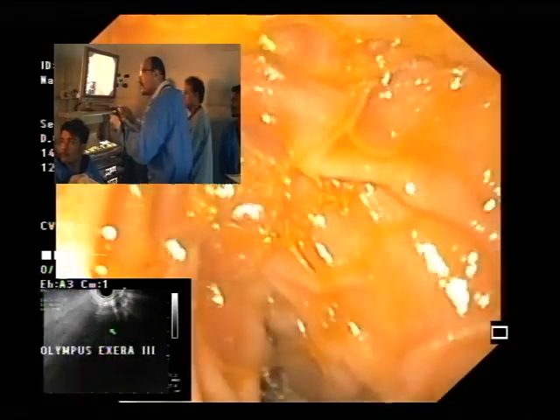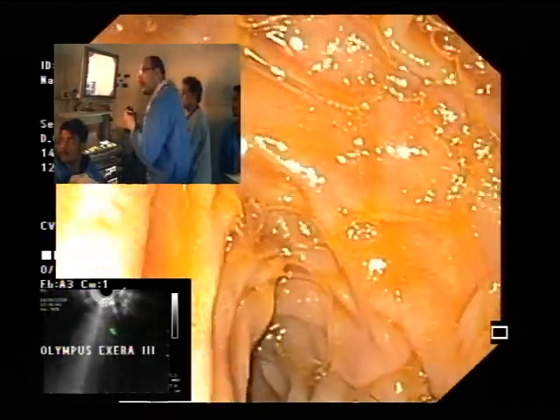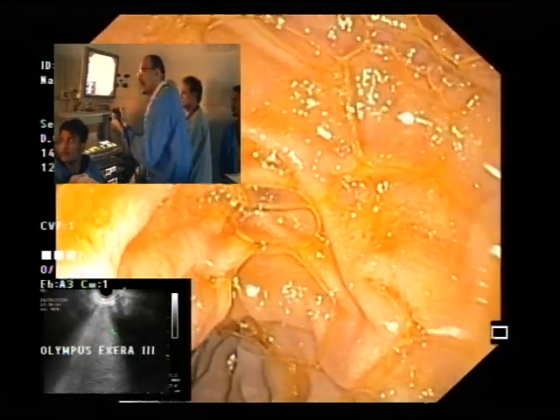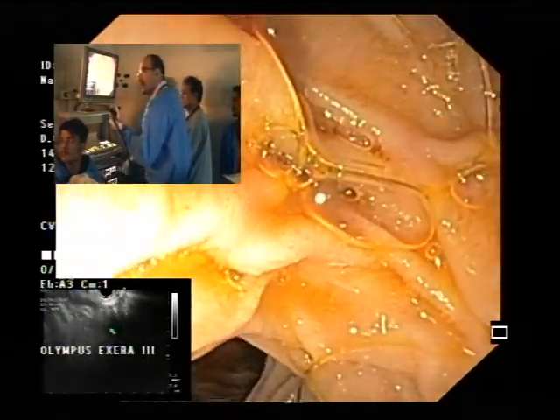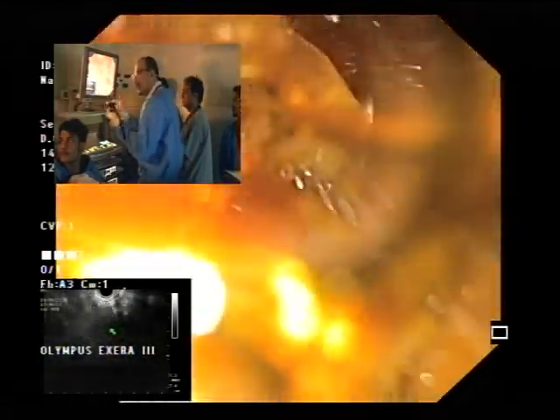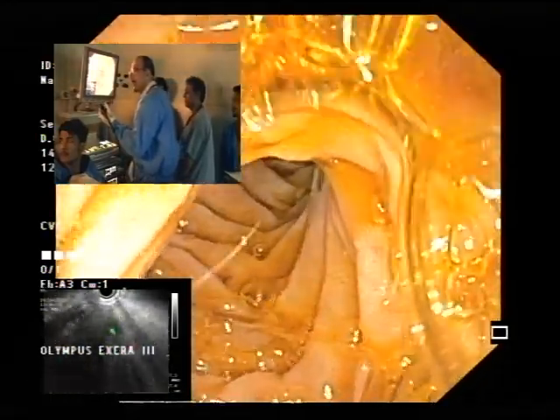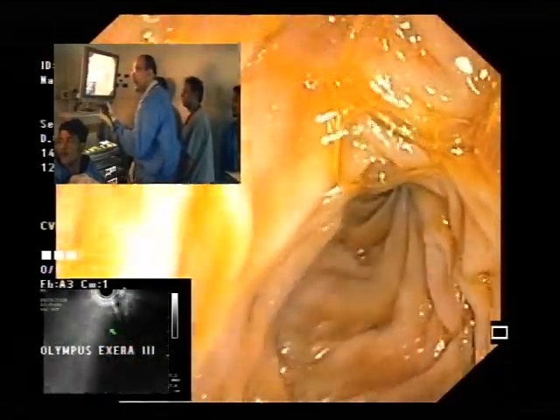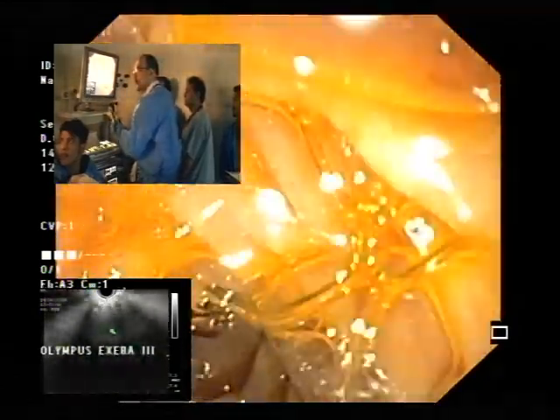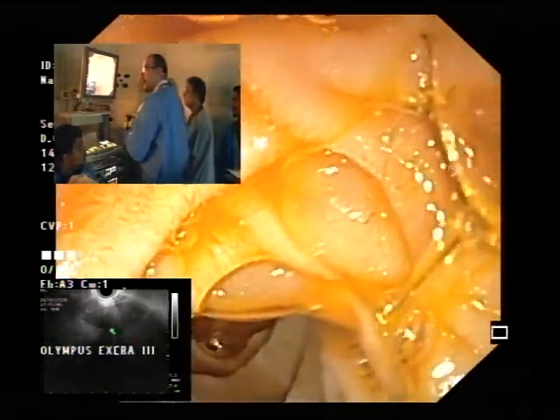And here I typically will reduce. My approach is a bit different from Khalid. I actually feel somewhat similar to Dr. Saad that the first and second tend to be similar. So I will typically actually come back and endoscopically look for the papilla. Unless I know that there's a lesion in the uncinate or deep uncinate, like a cyst that I want to look for.